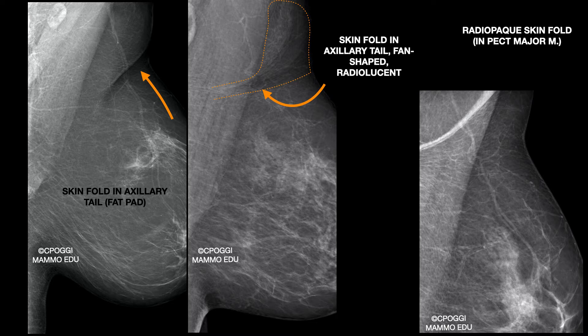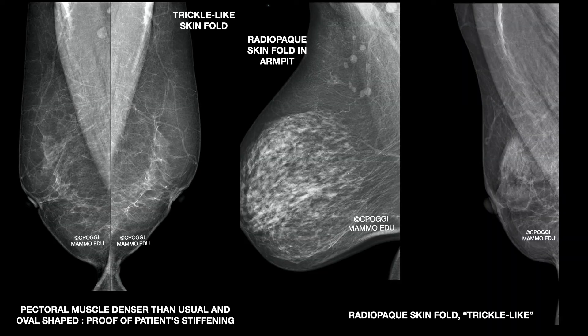Let's move on to another very common skin fold in the pectoralis major muscle. Very interesting here is what I call a trickle-like skin fold. You can find it only in patients with small breast and lean thorax, usually associated with stiffening of the muscle. You can also understand it by the shape of the muscle — oval, with a narrowing in the superior part.